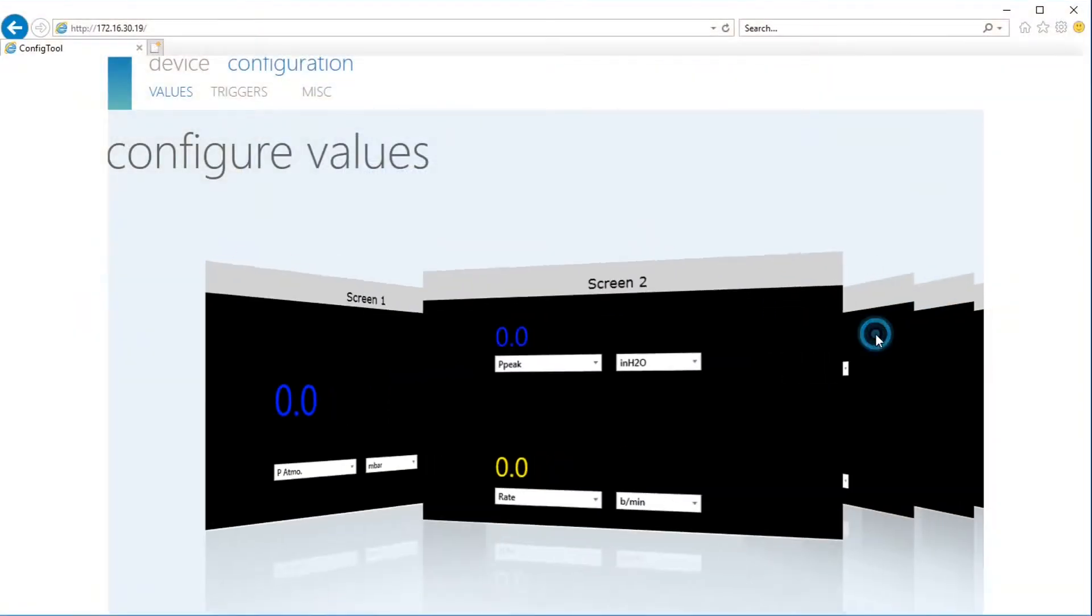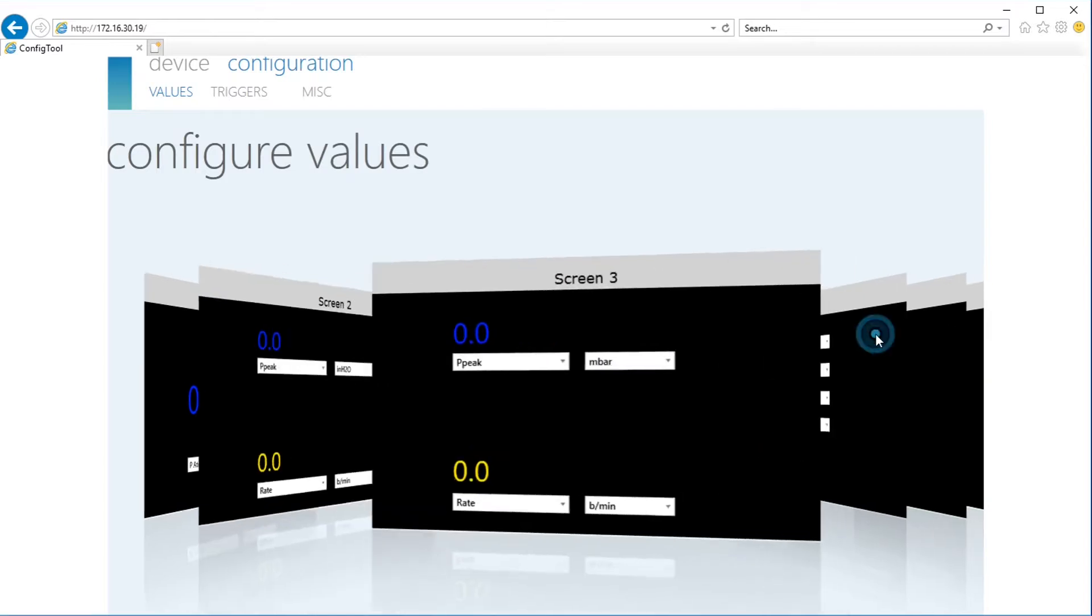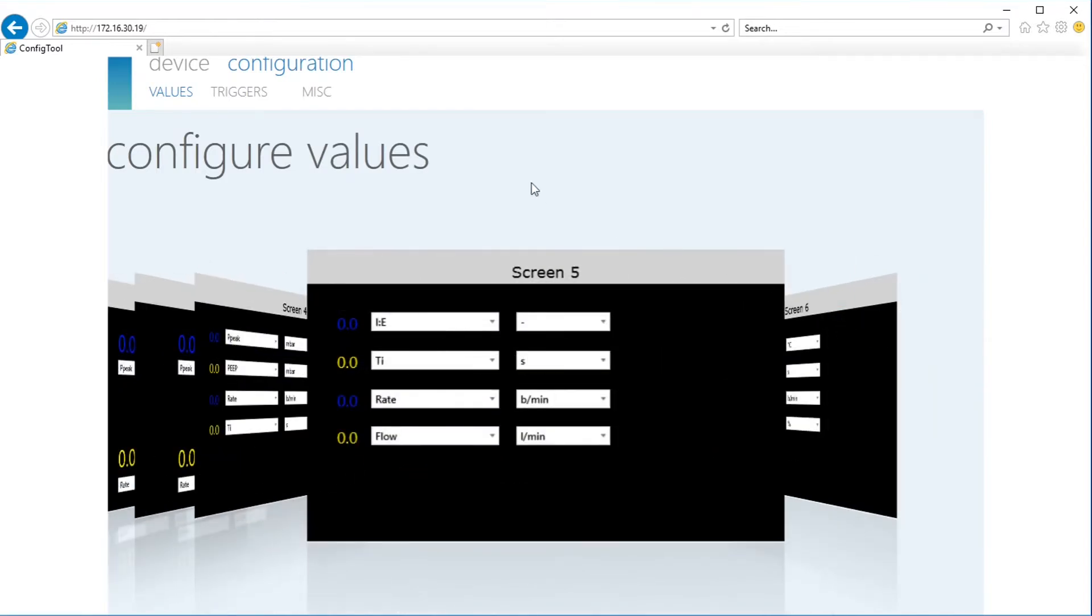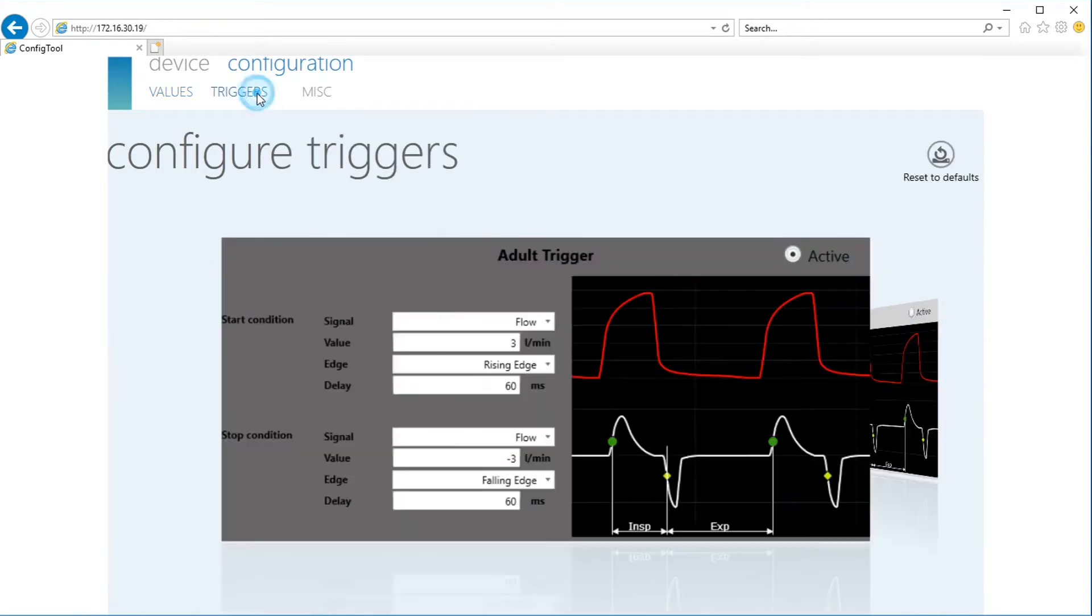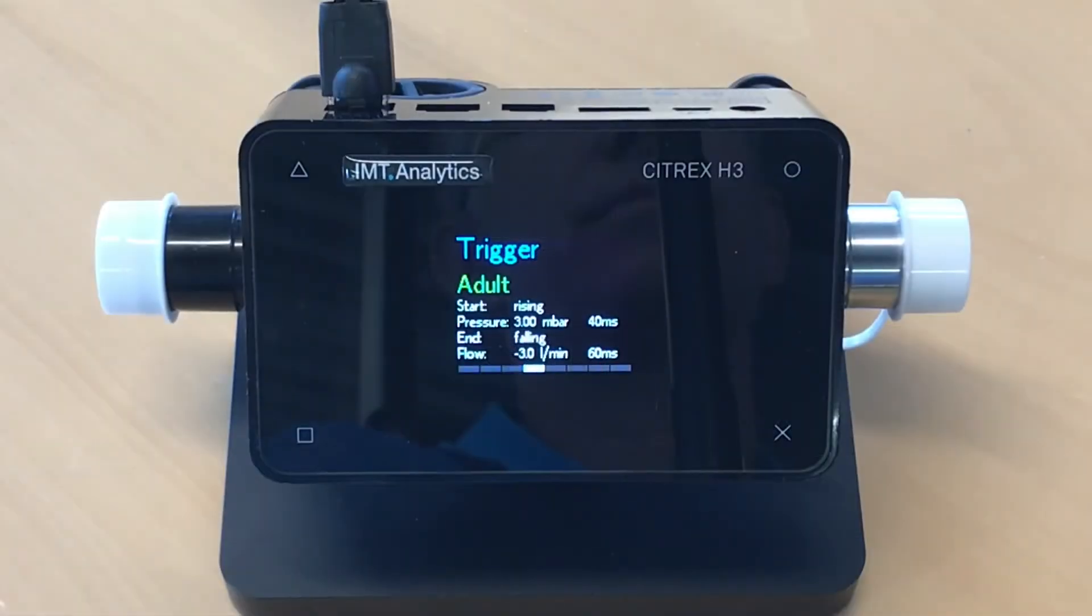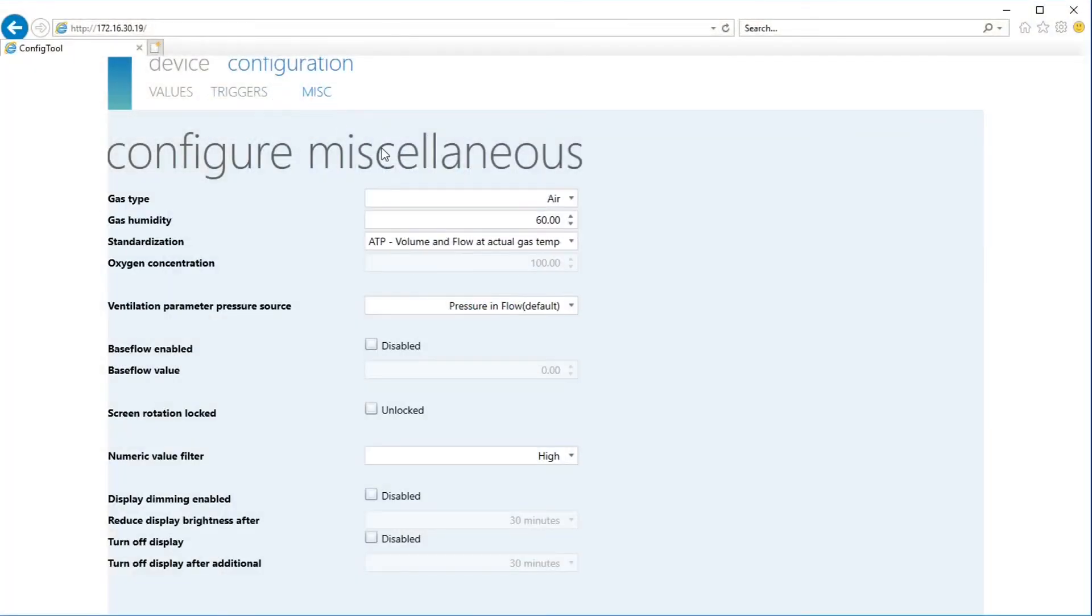You can flip through all the screens. It's very easy. Also, you can adjust the trigger settings which are important for volume measurement.